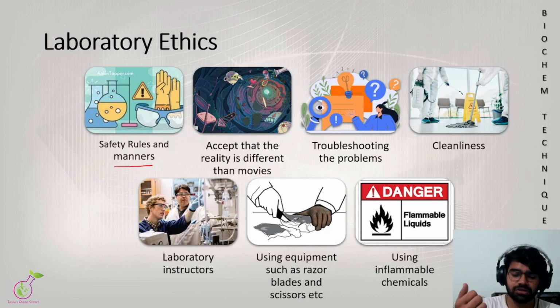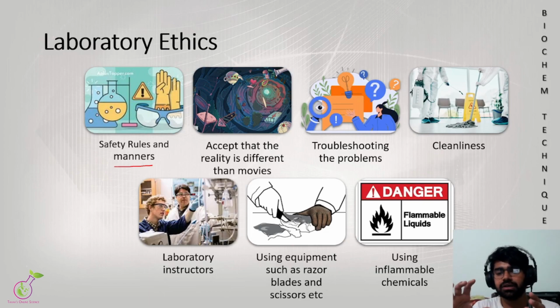You just don't play with a needle that has been touched with the patient's blood. You cannot play with the needle that has the patient's blood on it. You have to very carefully handle that blood. It's already drawn, yes, but you have to put it in the tube very carefully. That is further used for the separation and whatever the experiment is. So you have to be very careful about the plate.